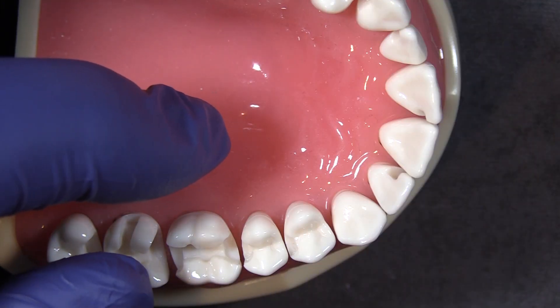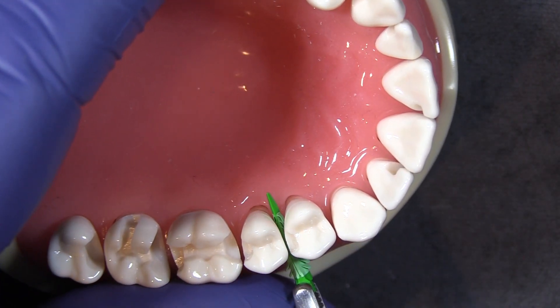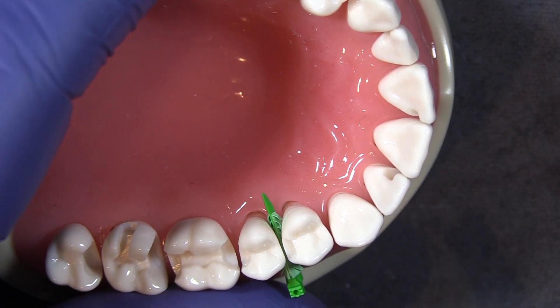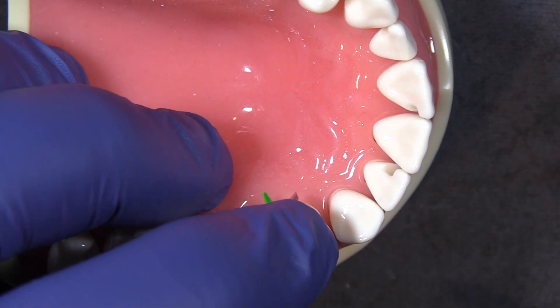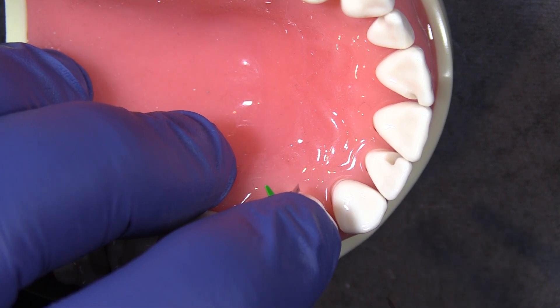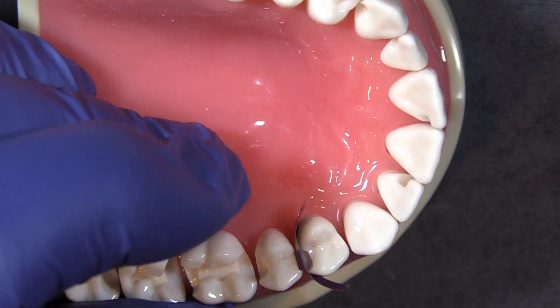Tip number two: we're going to call it the aggressive wedge technique. I'm going to aggressively apply a wedge — you can see that space opened up. I have a dead soft matrix band, I get it started, and then I remove my firmly placed wedge and apply apical pressure and the band slides right down.